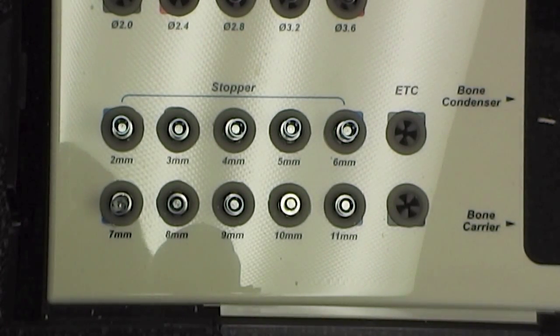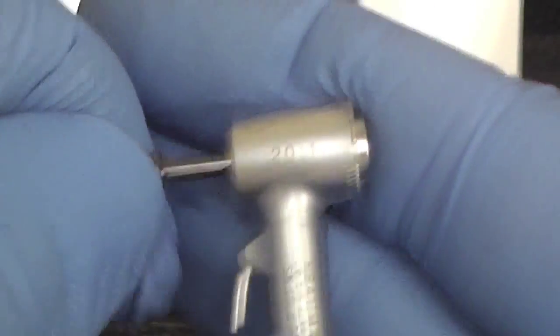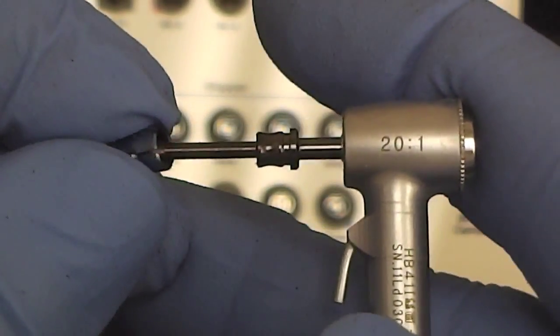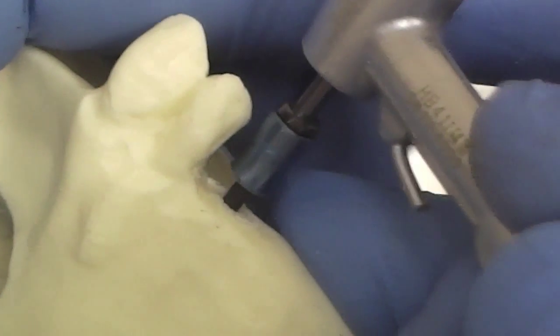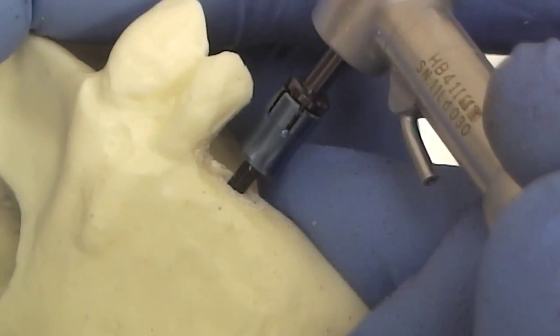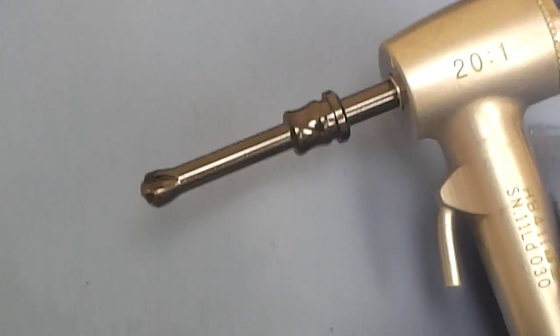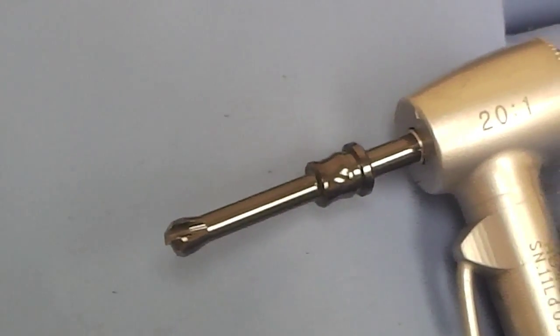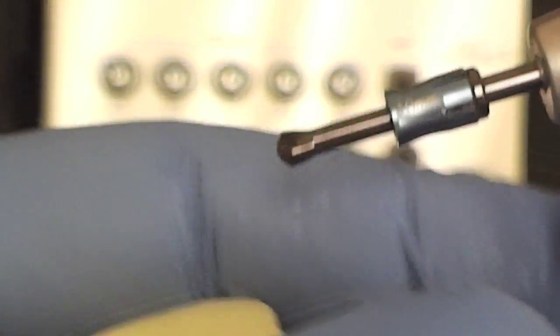Now we've been able to lift the sinus membrane at 10 millimeters. It's time to go to the next size drill, which would be 2.8 millimeters in the Blue Sky Bio surgical handpiece system, the X Cube, and put the same 10 millimeter stopper on top of the safe-sided drill. And again, the stopper prevents us from perforating. Check our membrane, make sure it's okay. We've now loaded the 3.2 safe-sided sinus reamer drill, and we're placing the 10 millimeter stop on it again, and we're ready to increase the size of our osteotomy to 3.2 millimeters.